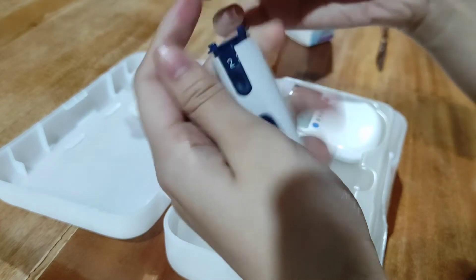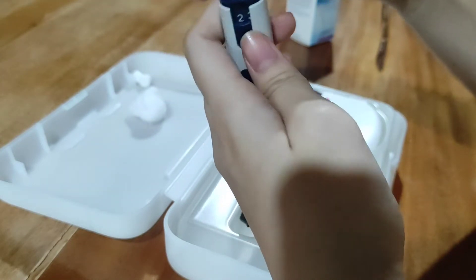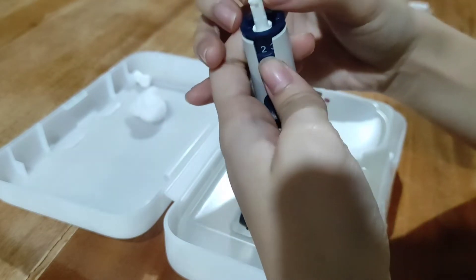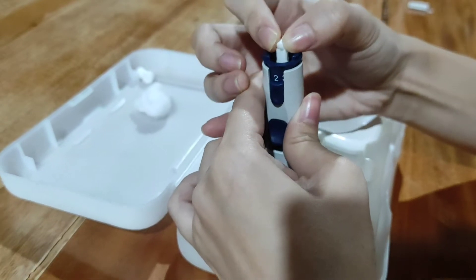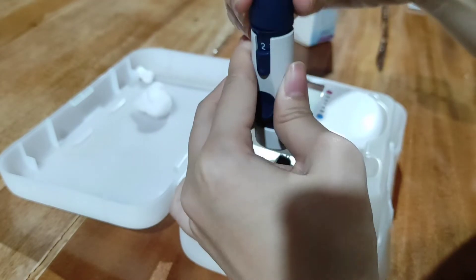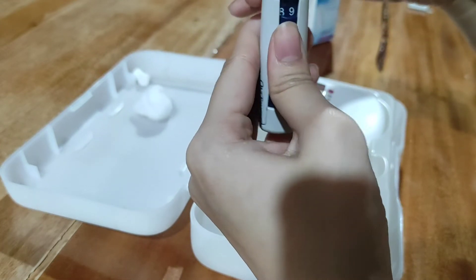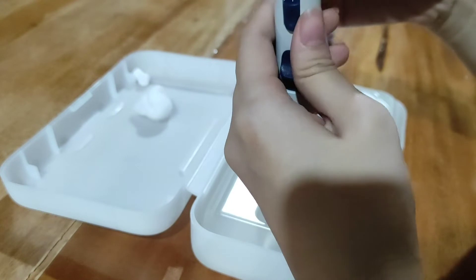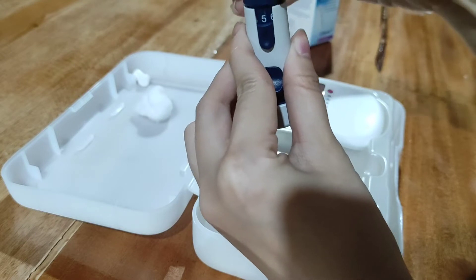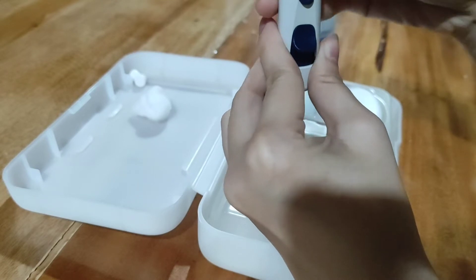Lalagay natin yung ating lancet sa lancet device. In this case, itong lancet device na to, you just got to push the lancet. Okay na yan, and then close na natin. Secure mo na natin. We're just going to close — okay na. Kita nyo yung doon, okay na.